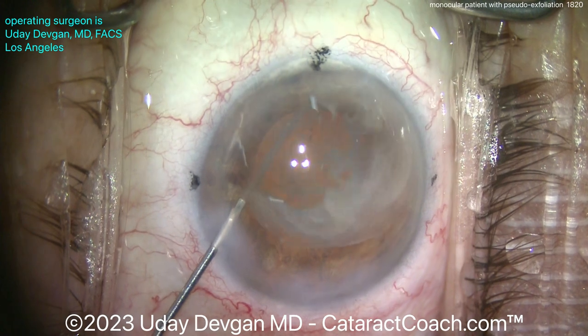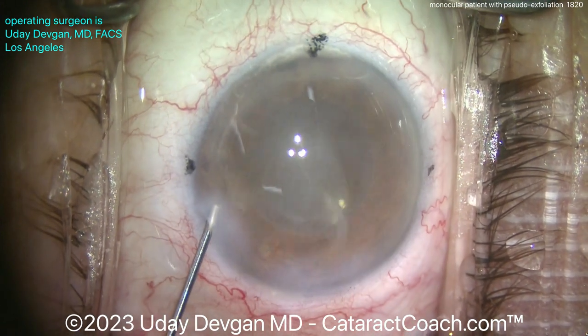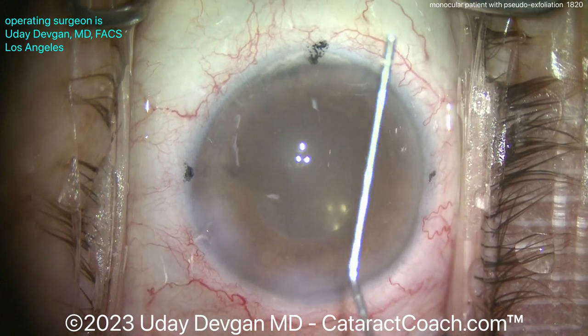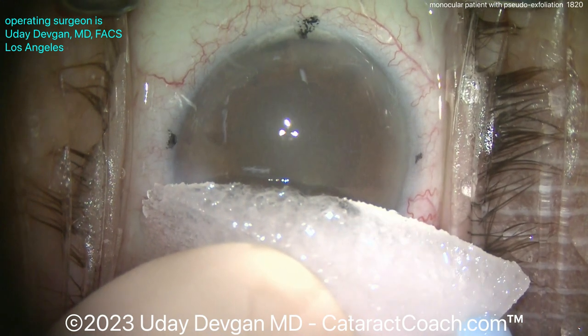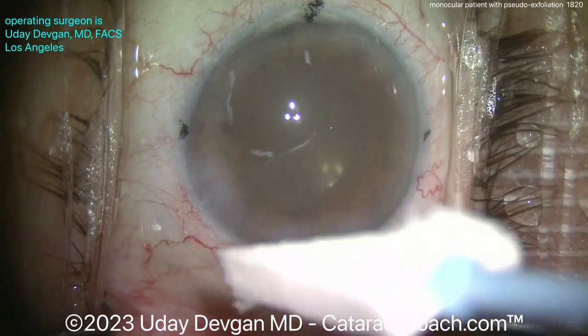Getting that lens tipped over just a bit more to get it perfectly lined up — now we're happy. Adding some preservative-free triamcinolone to quell post-op inflammation; it does not last long in the eye, mostly gone by tomorrow morning. The anterior chamber turns over every 90 minutes — 18 times a day — so do not worry about IOP spikes. Beautiful end of the case; nice low pressure. Let's make sure the incisions are watertight — beautiful.